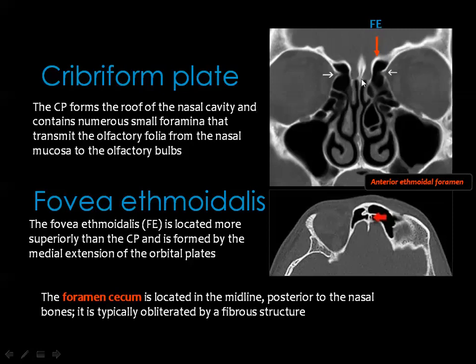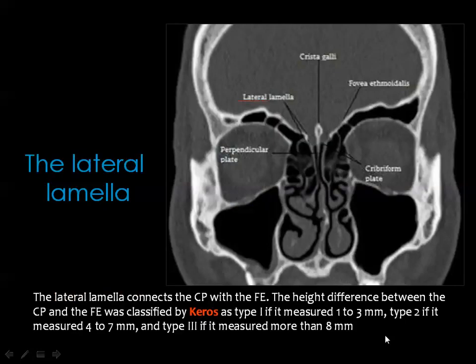One of the important structures is the cribriform plate of the ethmoid — this very fine horizontal blade — and this is the crista galli, and this is the depression for the olfactory bulb, or the olfactory groove. In this axial image you can see part of the frontal sinuses, and this arrow points to the foramen cecum, which contains nothing and is usually obliterated by fibrous tissue. This is what we call the lateral lamella, which is part of the anterior skull base — the junction between the cribriform plate and the fovea ethmoidalis.